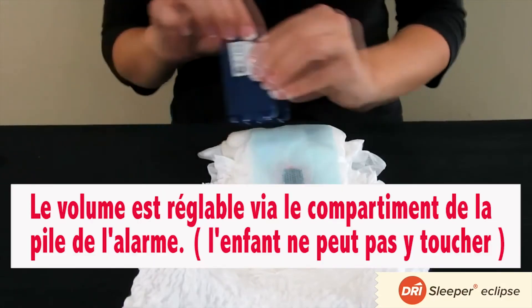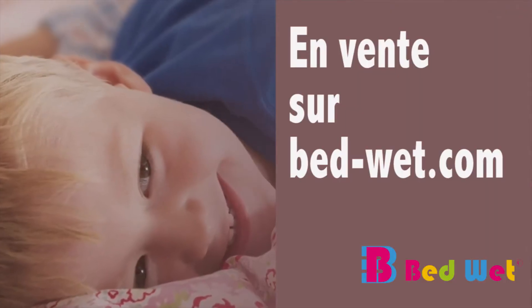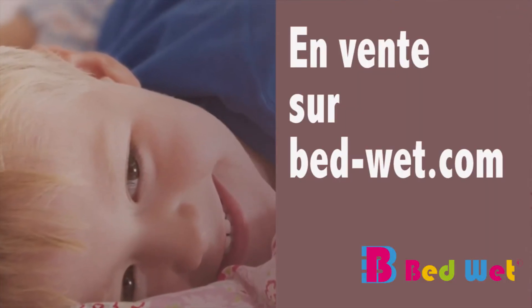The volume can be adjusted from inside the battery compartment. To learn more or to order an alarm, visit our website or call now.